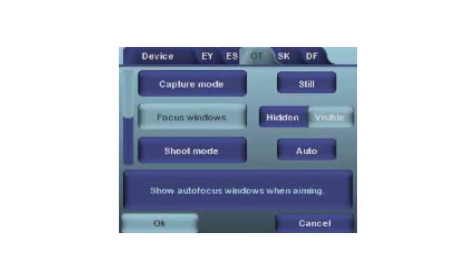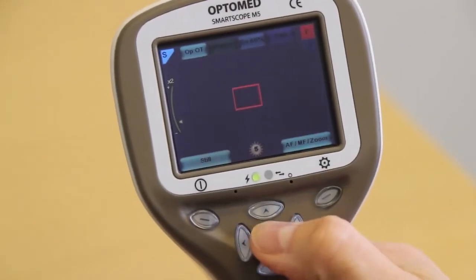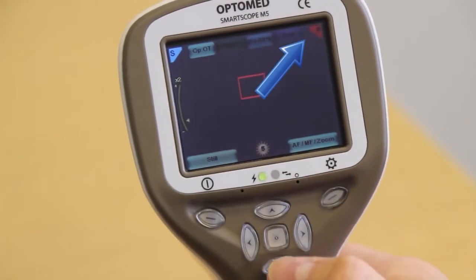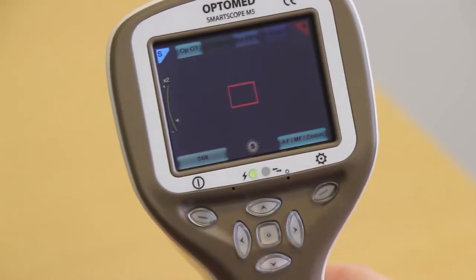Focus window. The focus window feature helps the user target the correct focus area in the image. You can hide or enable the focus window in the OT menu. The focus window is activated by pressing the middle key until the icon F appears in the screen. Move the red focus box by using the arrow keys.